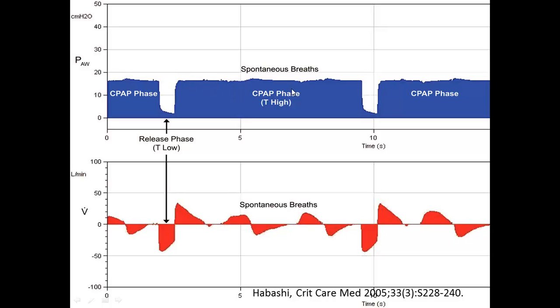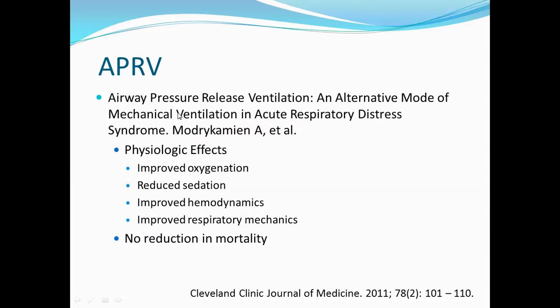We set the pressure high. We set the time high. We also set a pressure low, which usually is set at 0. However, time low is set so short that we end up with auto PEEP, so this pressure shouldn't drop back down to 0.